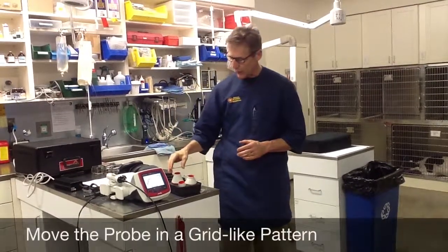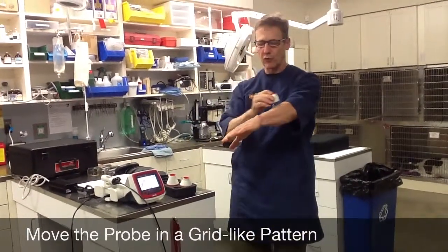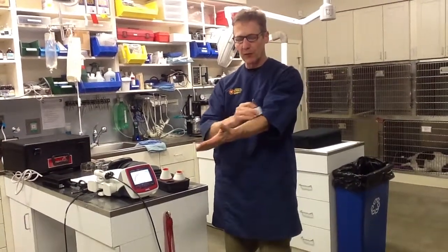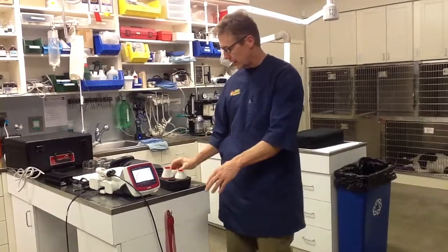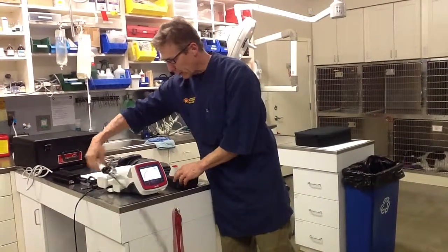When we're applying the laser therapy, we always want to be moving in a grid-like pattern. It's a little more difficult on a forearm, for example, because you want to move this way, and moving across like this involves extra motion. Let me show you with the handpiece how that would look.